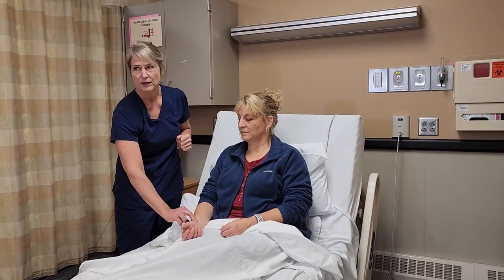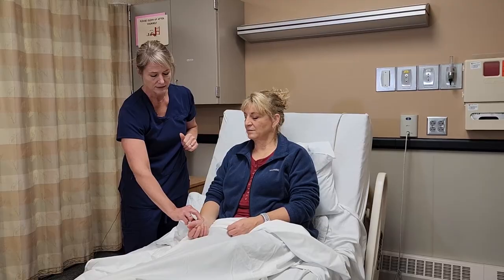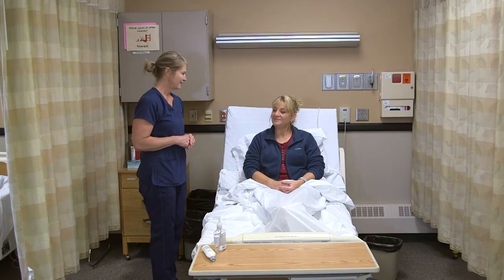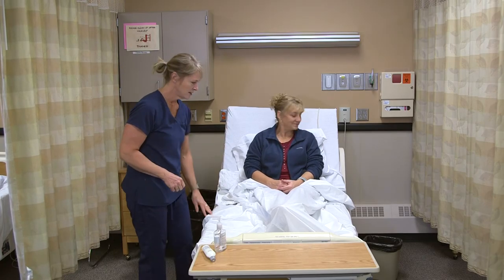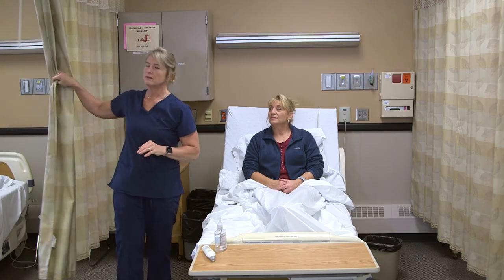When she inhales and exhales, that's one respiration. If they're regular, I'll do that for 30 seconds. Her pulse was 78, which is normal. I'll check if there's anything else she needs, confirm she's comfortable, ensure the call light is there, and that the bed is lowered and locked.